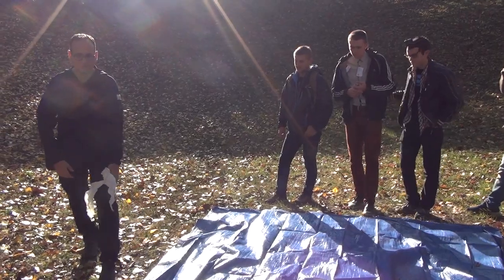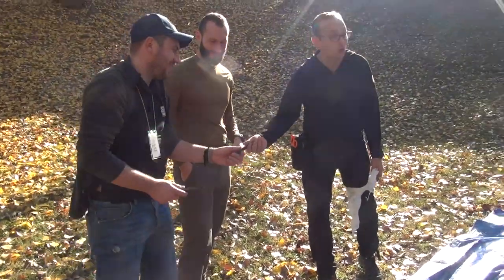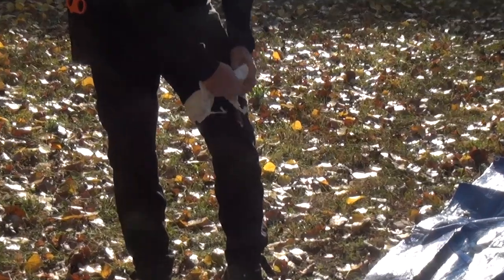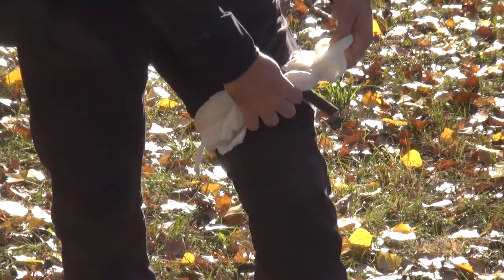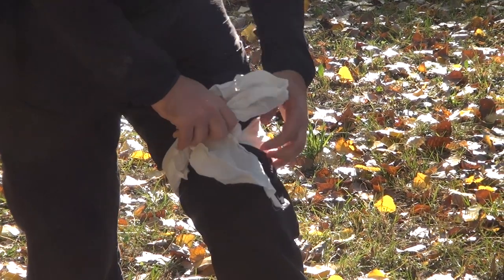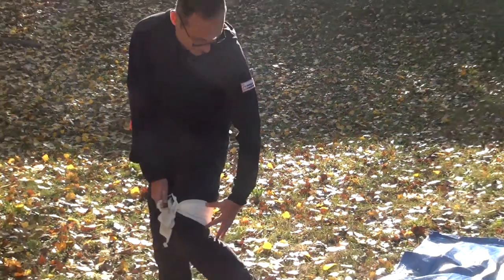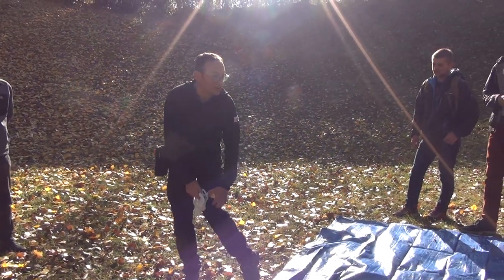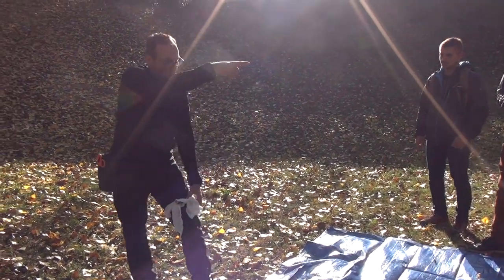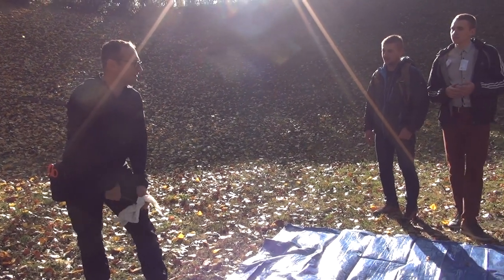Do you have a stick here? No. Here. Maybe a little bit stronger stick. But you put it on top, like this. And you turn until the bleeding stops. It's harder to control such a tourniquet. It is harder, but the most important thing is that it's wide, that it's not cutting. So it should have some width, and then you just pull it under like this. Of course, these ones are much better also for transporting the patients. You have to be careful that it doesn't loosen.